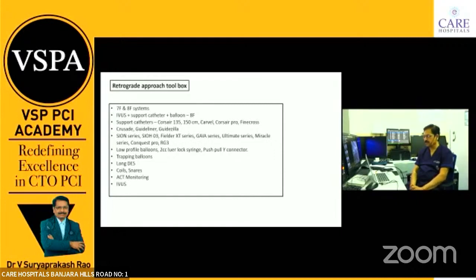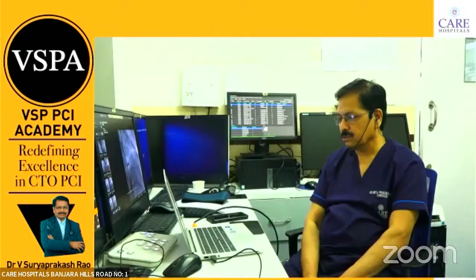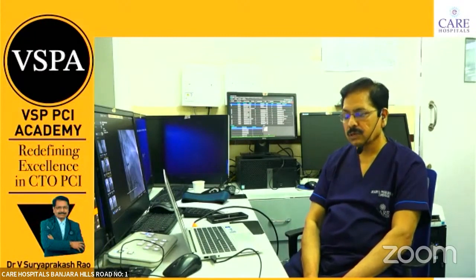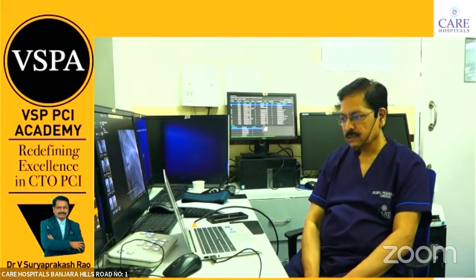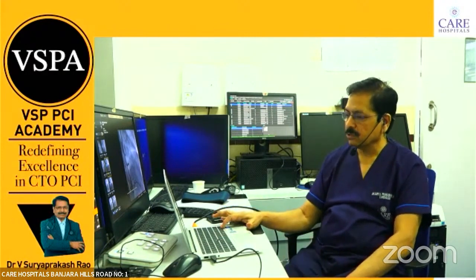Exactly, very important. Now, when you are dealing with retrograde, you have to maintain around 350 because the ACT monitoring, do it every half an hour and it's checked, because thrombosis in the donor artery is catastrophic. That's why it is there. And IVUS, as I told, IVUS systems are a must in retrograde.